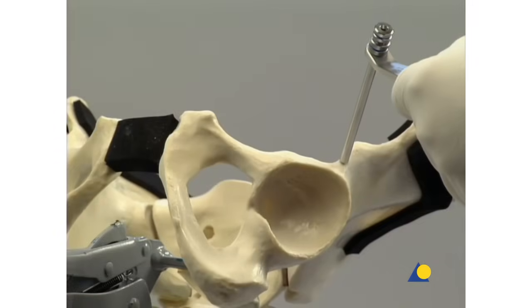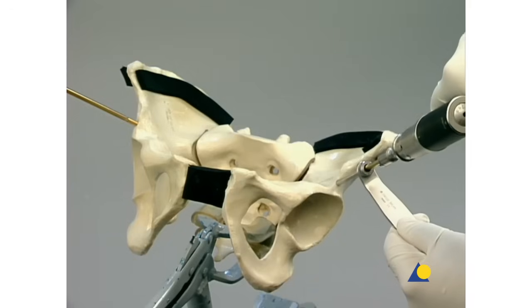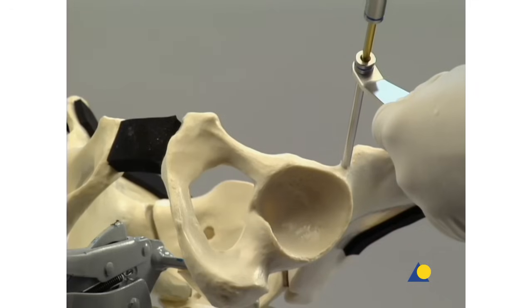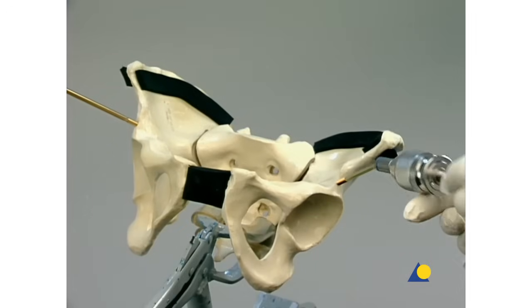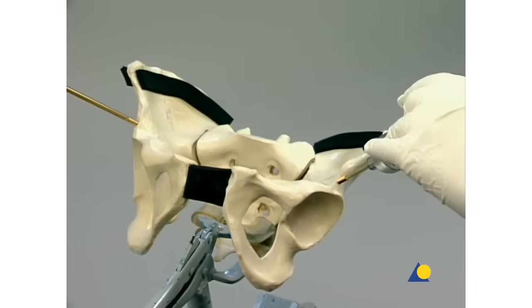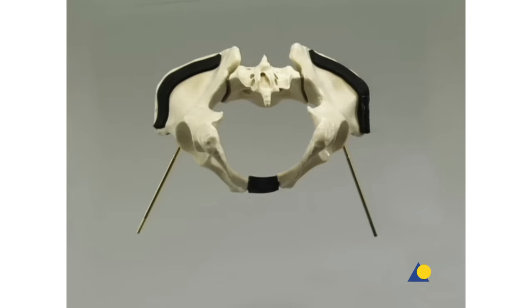On the contralateral side, the second Schantz screw is inserted using the same technique. It too is angled 20-30 degrees medially and 10-20 degrees cranially. Following the correct insertion of the second Schantz screw, the symmetry of their positioning is apparent.